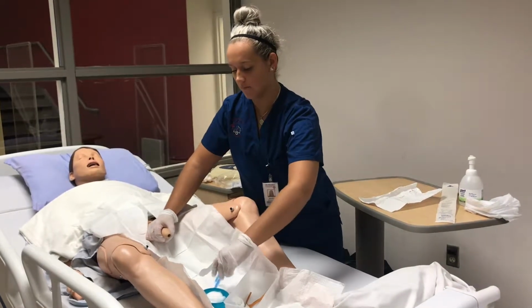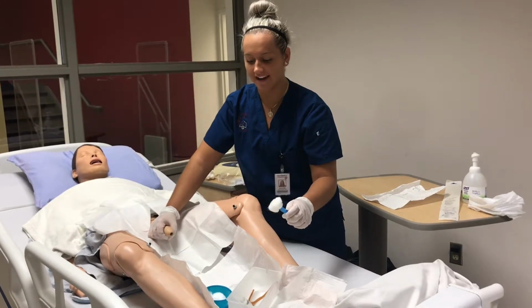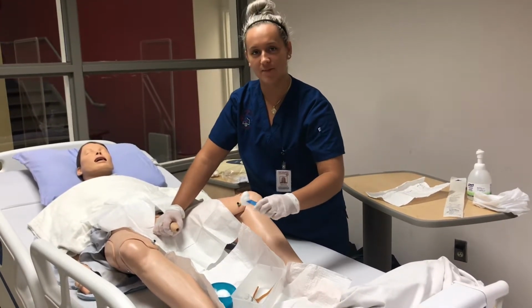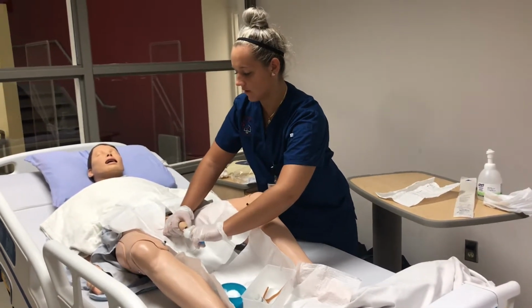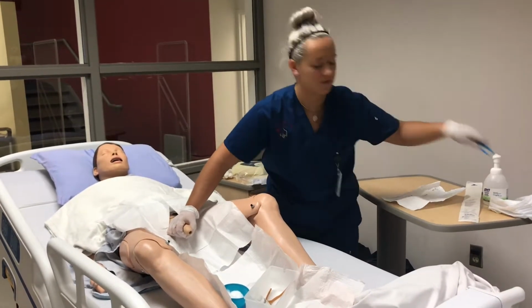So I'm going to begin by taking the cotton pads soaked in iodine solution, and I'm going to use 3 of them and clean the tip of the penis with about 3 different ones, and each time just going in a circular motion. You're going to want to do that 3 times to ensure that it's clean.